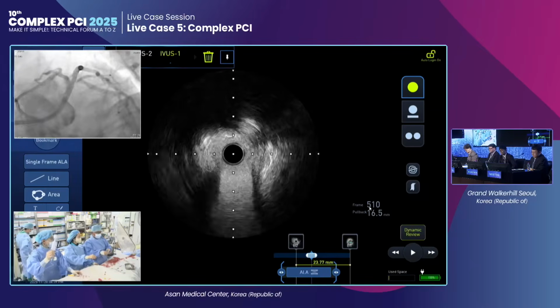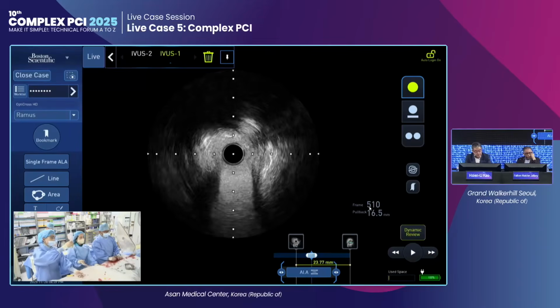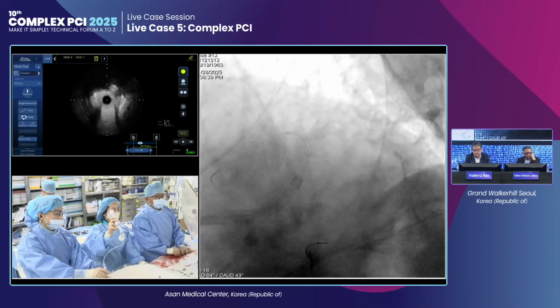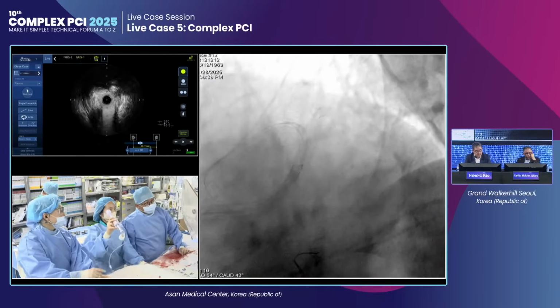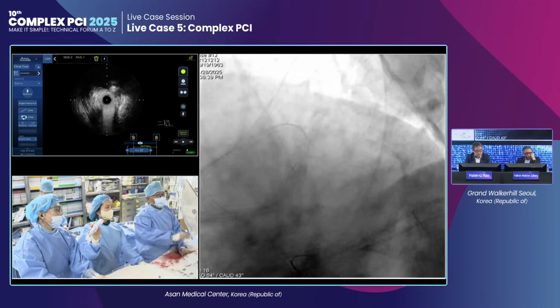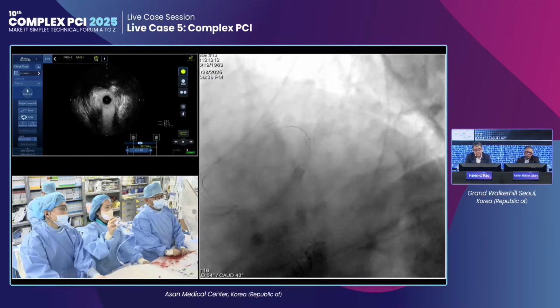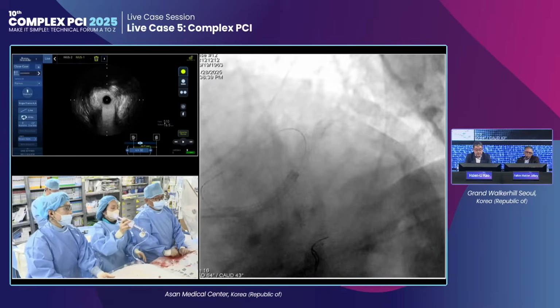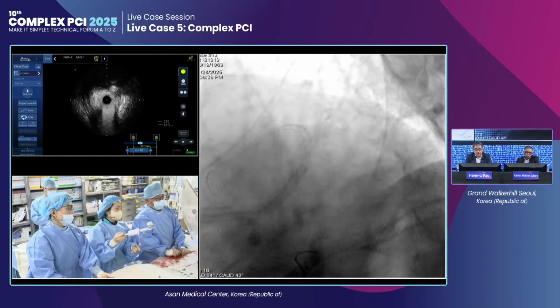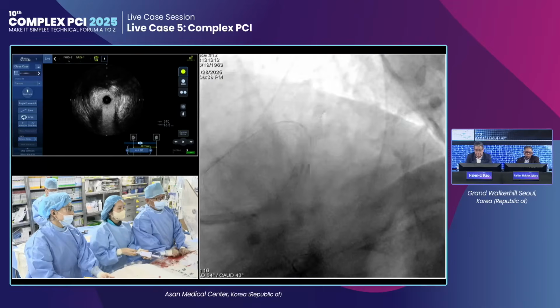So you crush the ramus stent from the LAD. Now at the circumflex ostium, you have 2 layers of stent. No, one layer actually, because the stent crossed. The crushed stent is actually facing the circumflex ostium. Yes, and then you are doing another stent from LAD to left main. So the circumflex will actually be behind 3 layers of stent.